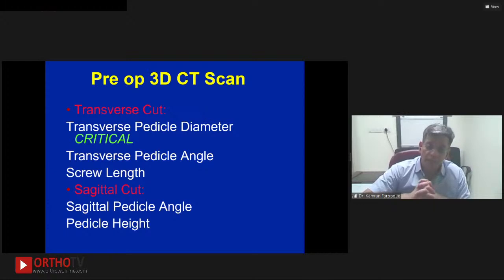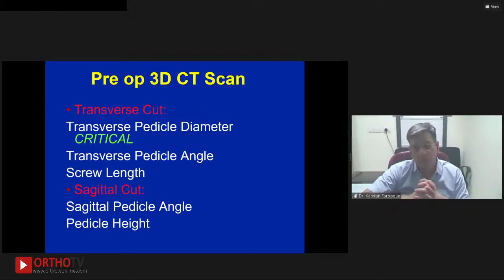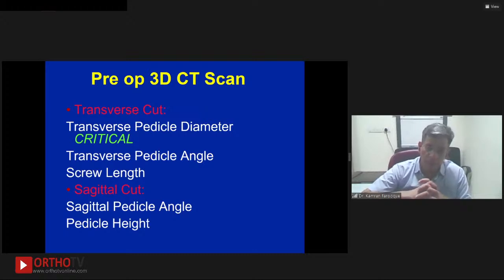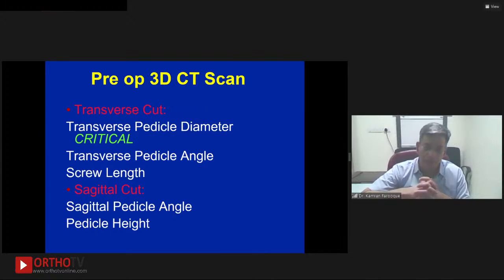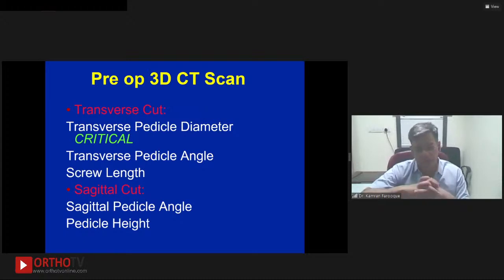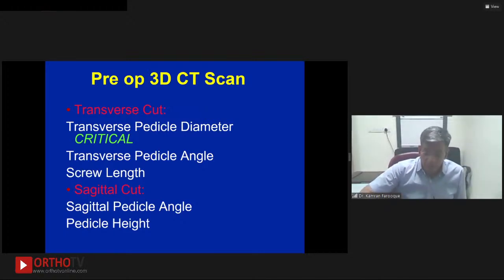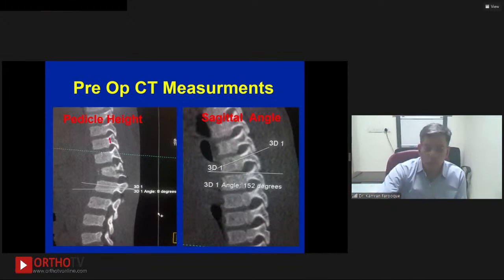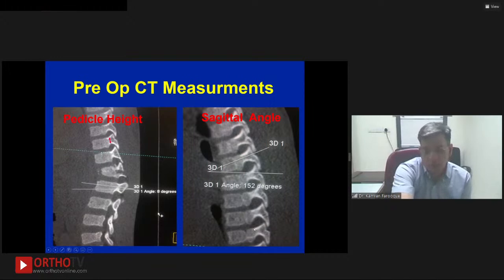When looking at the CT scan — nowadays we get CT scan for all spine patients — always have a look at the transverse cuts for pedicle width and transverse pedicle angle, as well as the approximate screw length at each level. On the sagittal cut, look at the pedicle height and the sagittal pedicle angle, which gives an idea of the craniocaudal angulation needed. As you go down the thoracic spine, especially in the mid and upper thoracic spine, you have to angle the screw more caudally. At D10, D11, the sagittal angle is nearly flat.